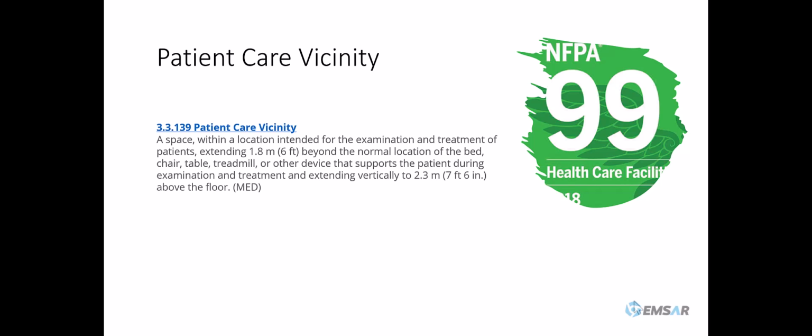NFPA defines patient care vicinity as a space within a location intended for examination and treatment of a patient, extending 1.8 meters or 6 feet beyond the normal location of the bed, chair, table, treadmill, or other device that supports the patient during examination and treatment. And this area also extends vertically 2.3 meters or 7 feet and 6 inches above the floor.